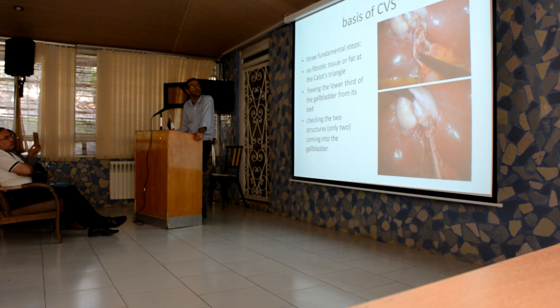Basis of CVS, the critical view of safety, three fundamental steps: no fibrotic tissue or fat in the Calot triangle, separating the lower third of the gallbladder from its bed, and checking that only two structures come into the gallbladder.